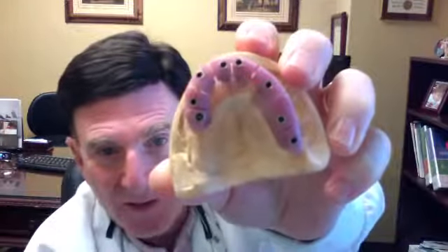So you can see, I'll put a clearer picture up here. And we haven't tried this in, obviously. This just came in, so I had a couple minutes. I thought I'd put this up. But it's very important that this model be accurate. With a single implant, different story, because then the problem doesn't exist. But once you have multiple implants, it's very important that you create a verification index, at least in my opinion, and make sure it all fits. Hope this makes sense. This is mainly for dentists, not for patients.